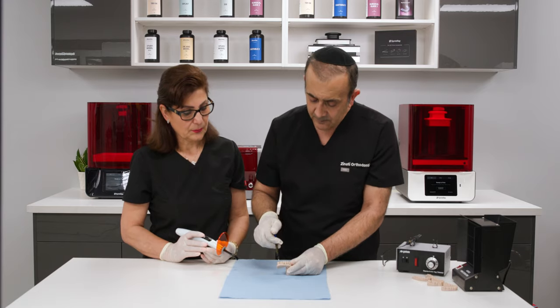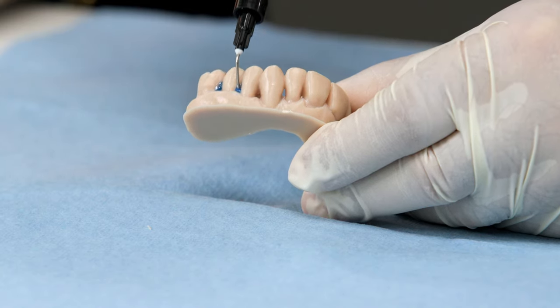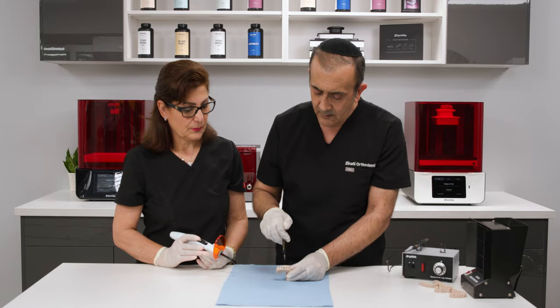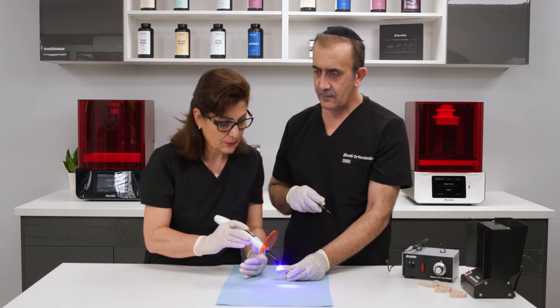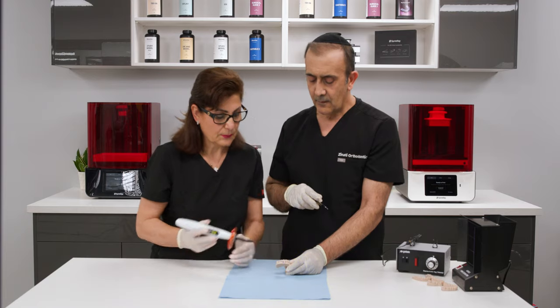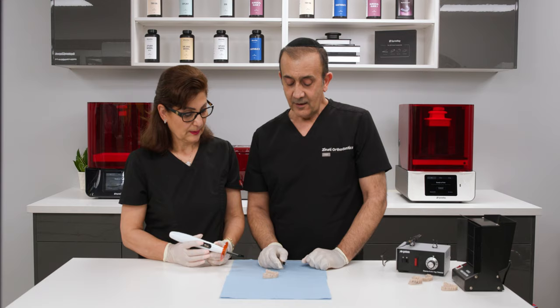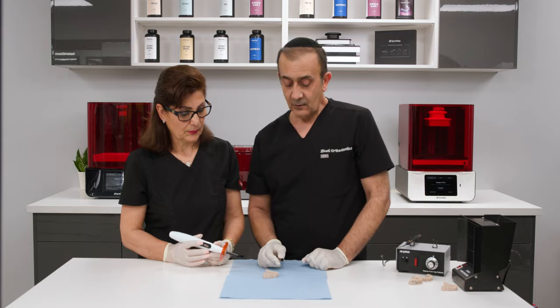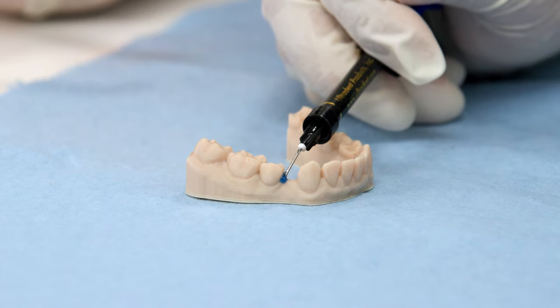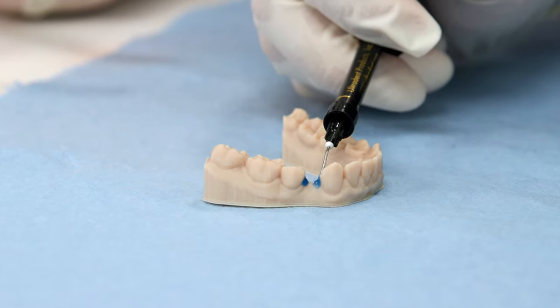We're going to fill in those spaces with our block-out resin. This is a flowable material so it's easy to get in there. We'll cure the resin — going through the whole model on the buccal and lingual. For the missing tooth case, we're blocking the undercuts on the mesial and distal of the adjacent teeth to make sure our plastic does not catch those corners.